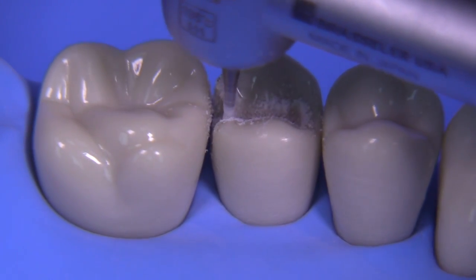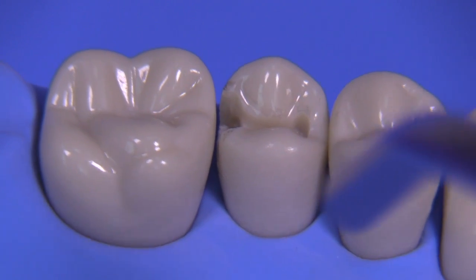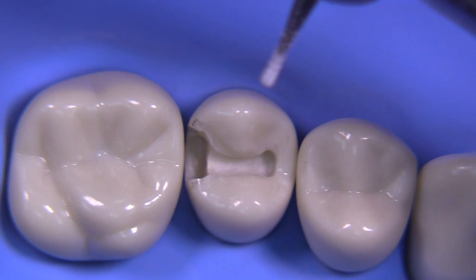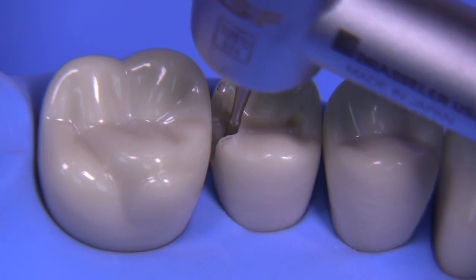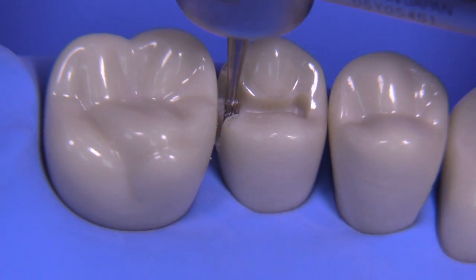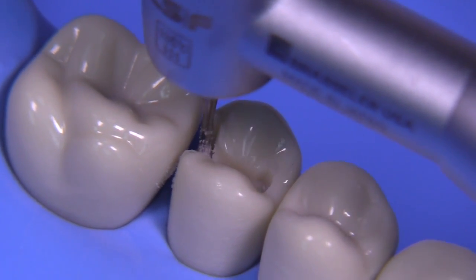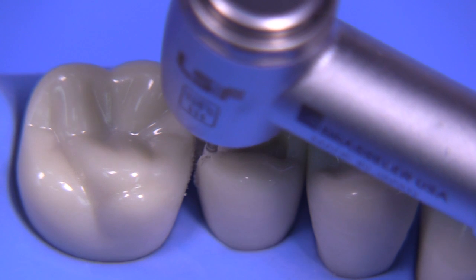If you're not using an electric handpiece in your office, I think you're really missing out on something incredible — but sometimes we just don't have those things. So if you're practicing at home or in a dental school that still has a turbine system, this is a great alternative. I'm going to switch over with the slow speed to the 245 burr and do a few things: make sure that the axial wall is tipping inward towards the occlusal, and make sure that the lingual proximal wall is leaning towards the facial, creating an acute angle relative to the gingival and a right angle with the buccal wall relative to the gingival.